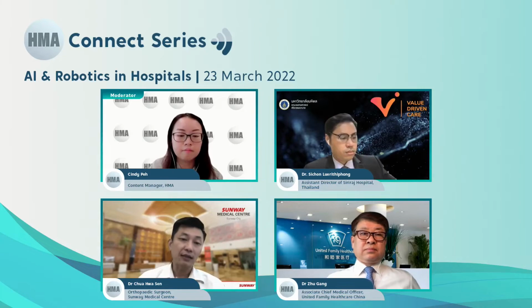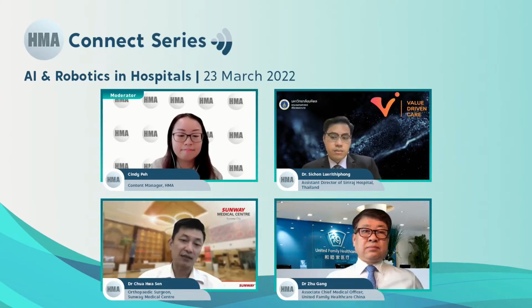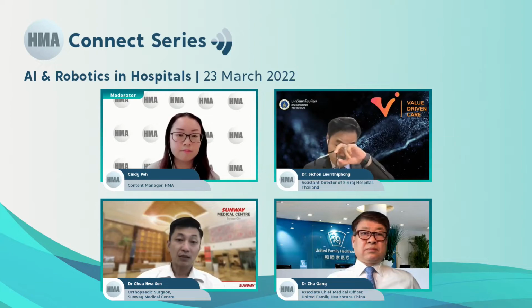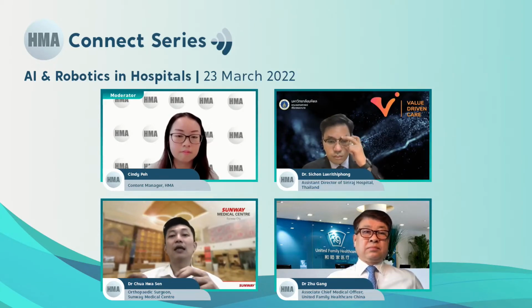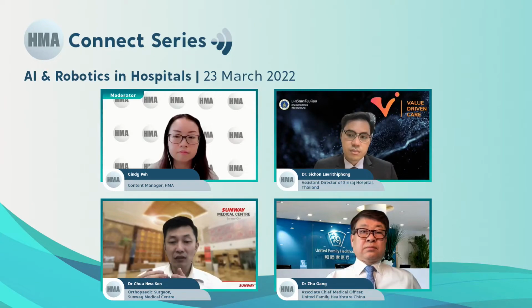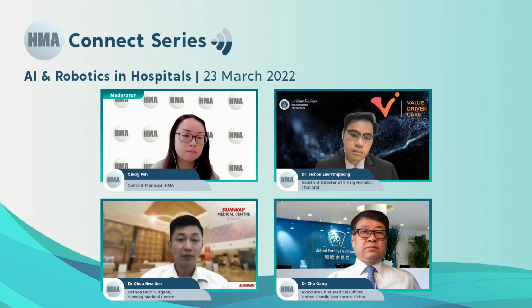Secondly, the usage of pain relief post-operatively is less because we are using the robotic. This is number two. Next, in terms of rehabilitation immediately after the surgery, the need for it is also less, because the joint is being put in more accurately, which leads to an easier rehabilitation. Next, with the joint placed more accurately, the longevity of the joint is going to be longer. So the patients with a new joint coming back for revision surgery will be fewer in the long run.